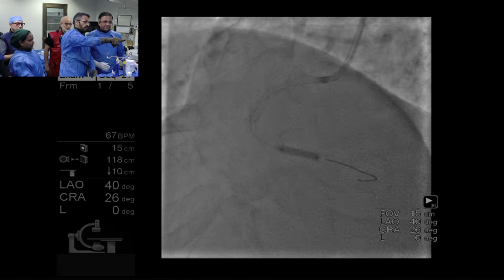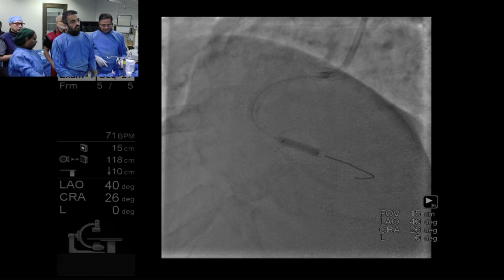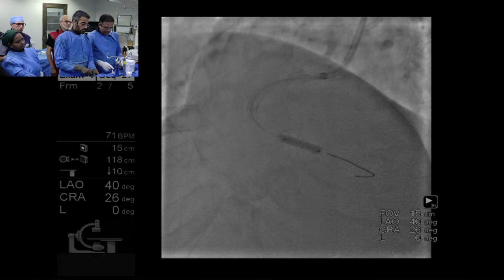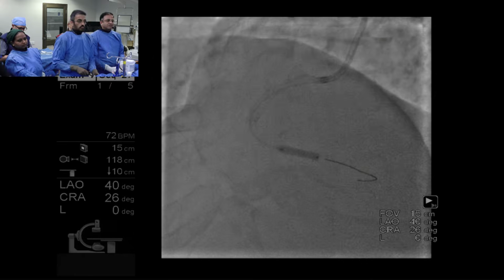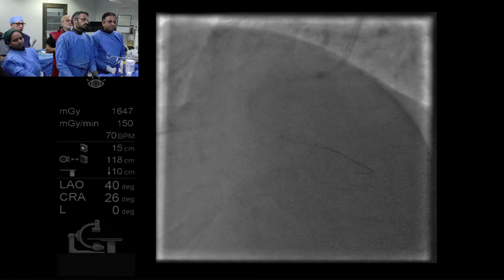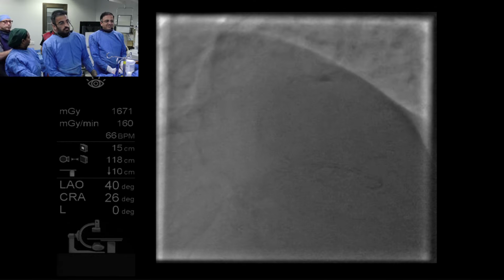The distal edge, I think we missed. But that's where the under-apposition was, right? Yes, so we'll probably engage that. Okay, down we will come a little further. I think it might dissect there.